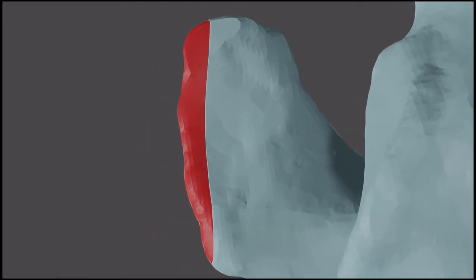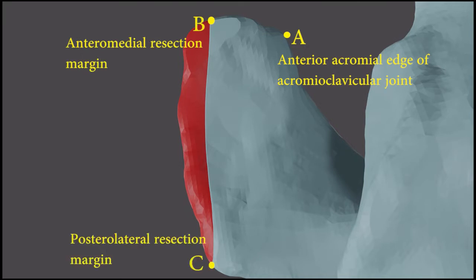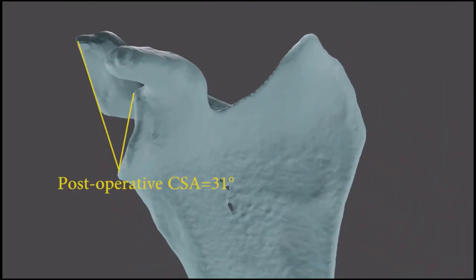Then the marker points of the resected bone borders are identified, including the point A, anterior acromial edge of acromioclavicular joint, the point B, anteromedial resection margin, and the point C, posterolateral resection margin, and the distances of AB and BC are measured. After removing the red region, the postoperative CSA will be measured again for confirmation.